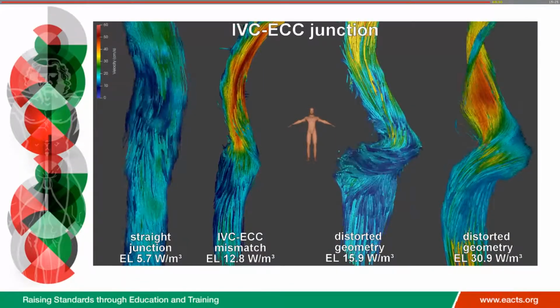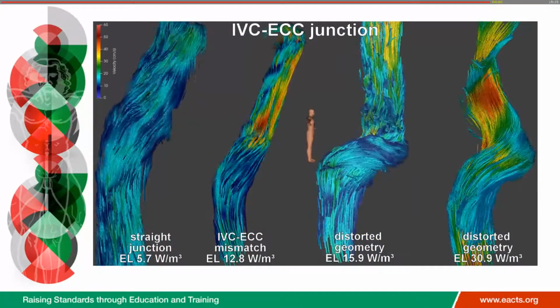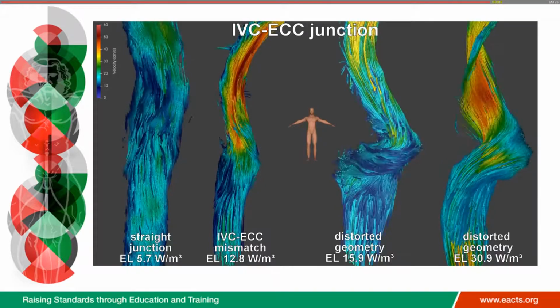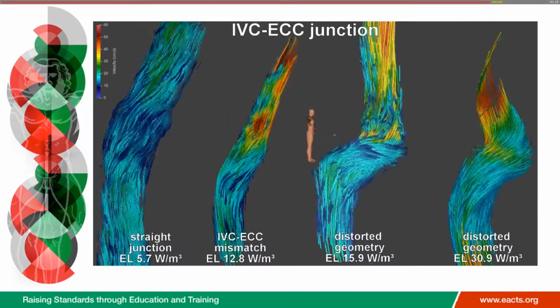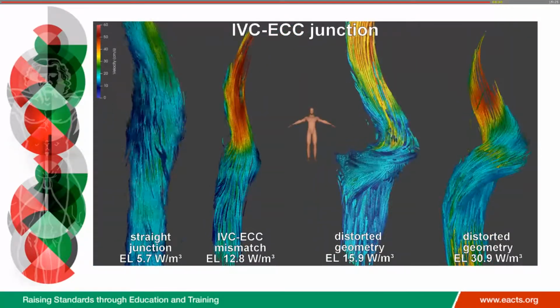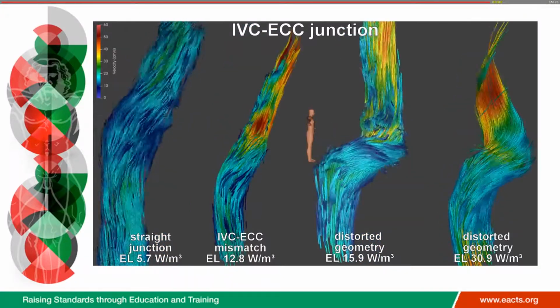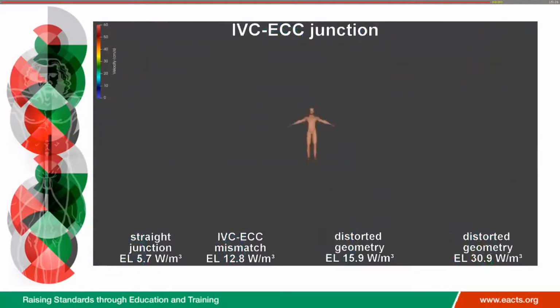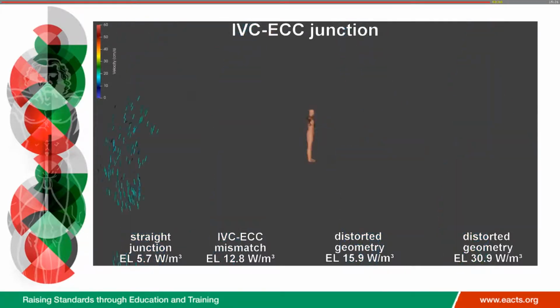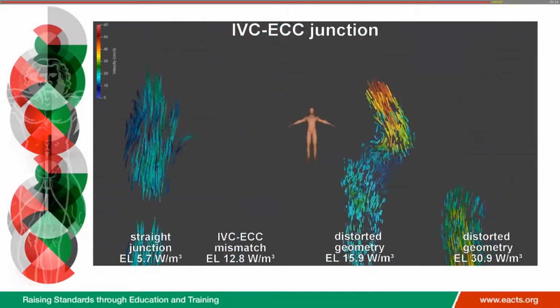Is there any impact of ventricular morphology, let's say dominant right, dominant left, or of the position of the heart on flow dynamics? So can we estimate in advance which patient will have good flow, which patient will probably be difficult to achieve? So most of the patients had a normal left-sided heart, and there was a normal connection. There was one patient with extracardiac, from the opposite side, inferior vena cava, but had a very nice, smooth path. But the other patients had normal position of the heart. And I haven't looked at the morphology of the ventricles, so I'm not sure if that has an impact.